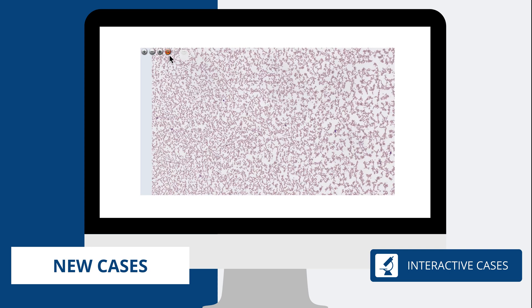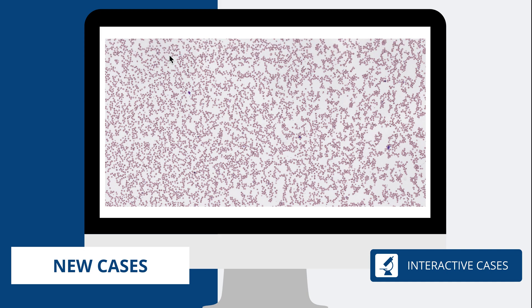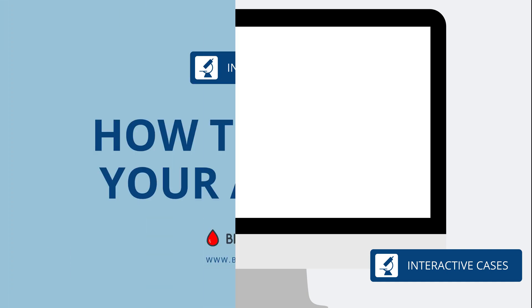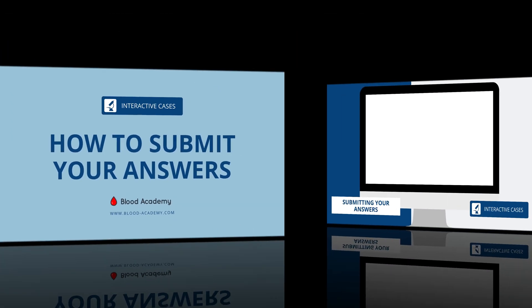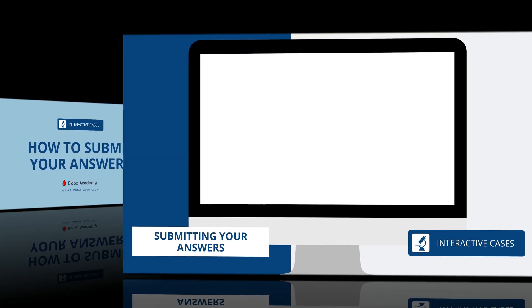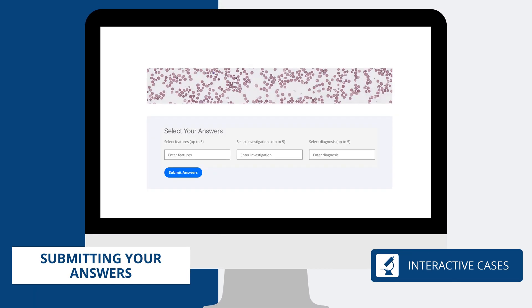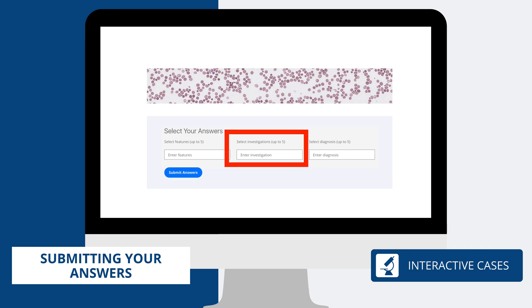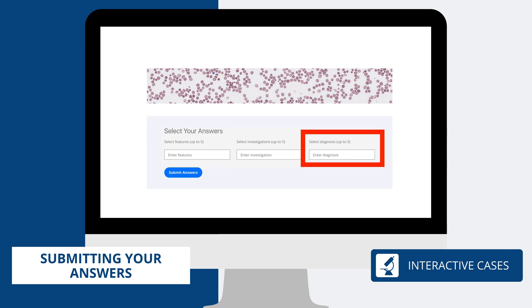Use the full screen mode to enlarge the slide image. Once you have an idea of what the case is about, you will need to submit your answers. These relate to the morphological features seen in the slide, supplementary investigations to help deliver a diagnosis, and a provisional diagnosis or diagnoses.